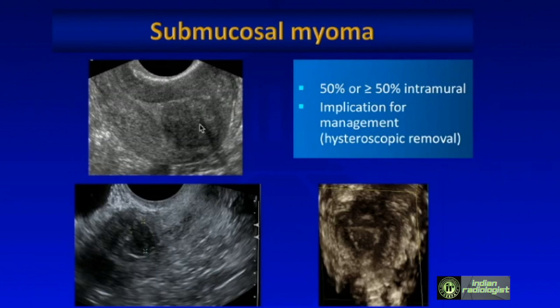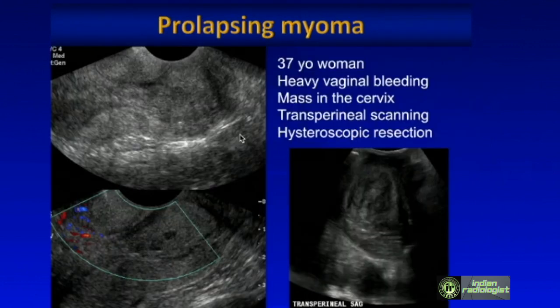A submucosal myoma distorts the endometrium with classic hypoechoic, shadowing appearance. We need to tell the clinician whether it is less than or more than 50% intramural, because if predominantly submucosal, hysteroscopic removal is possible; otherwise, myomectomy may be needed. The 3D imaging helps localize submucosal myomas correctly — in this particular case it is more than 50% submucosal.